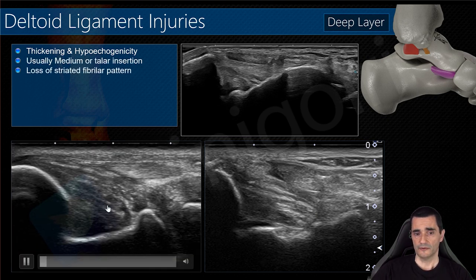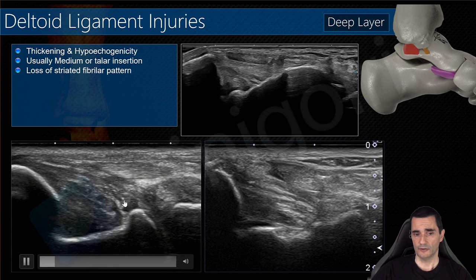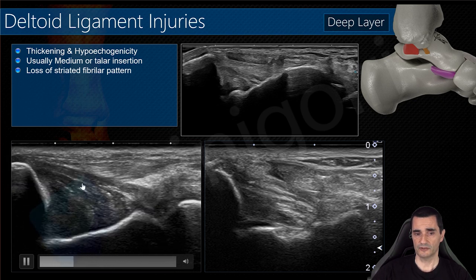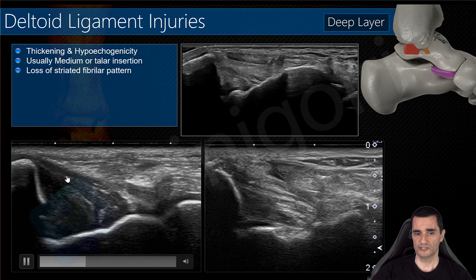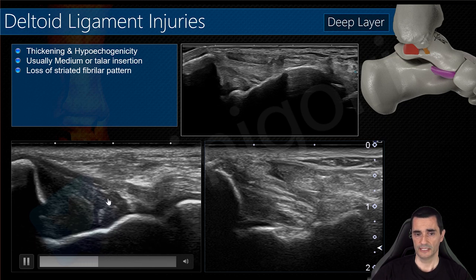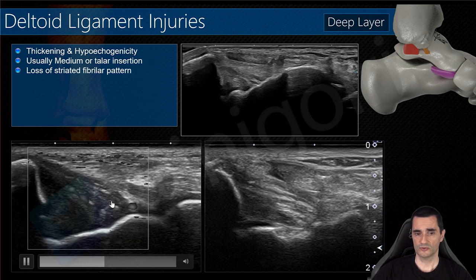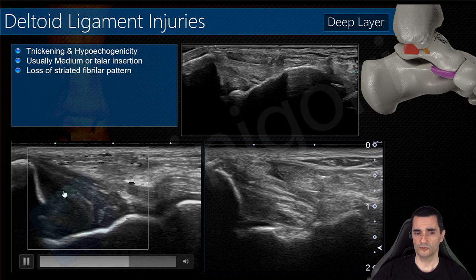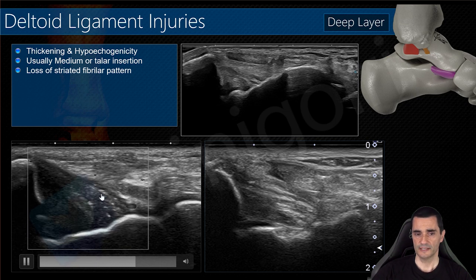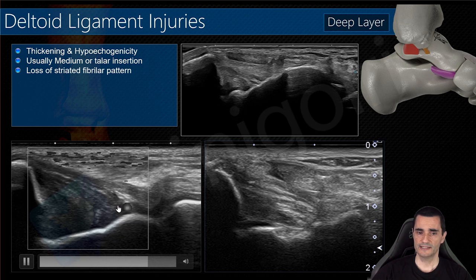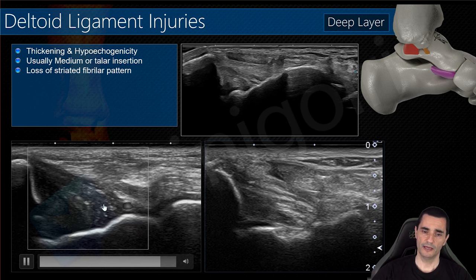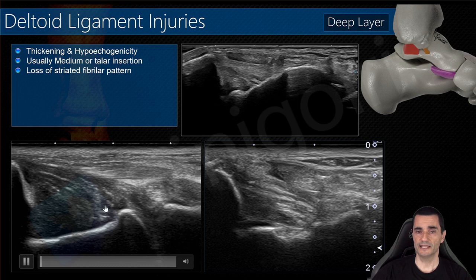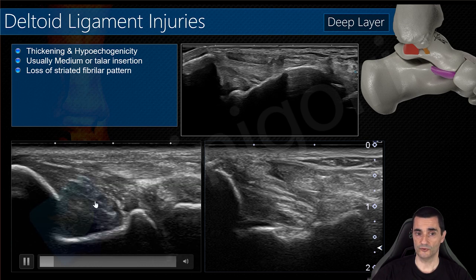This is another example showing thickening and loss of the fibrillar pattern of the posterior tibiotalar ligament. Sometimes it is difficult to assess, so we can use ultrasound Doppler to evaluate vascularization. Doppler can help us in mild affections or mild injuries.